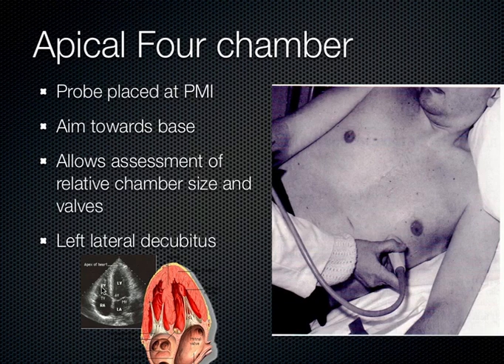As the right ventricle gets bigger and bigger, there could be some problems there with the right ventricle trying to pump blood against an obstruction like a pulmonary embolism. And so in the setting of massive pulmonary embolism, or blood clot in the lung, the right ventricle gets so big it approximates the size of the left ventricle. So that's how I use this view clinically.